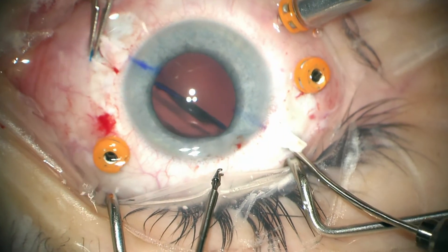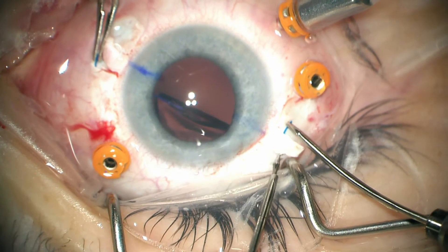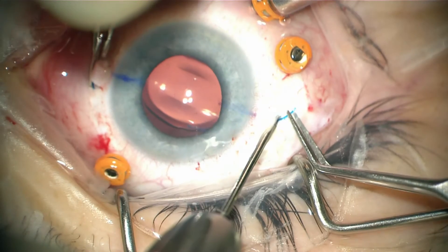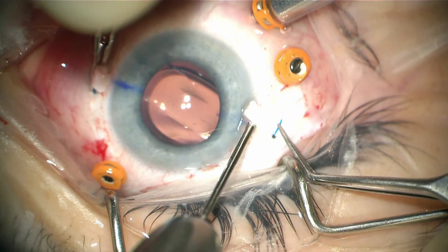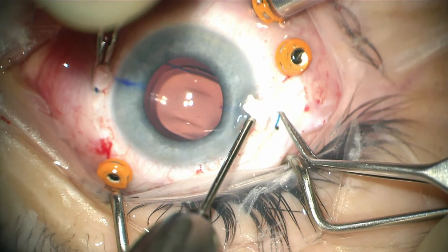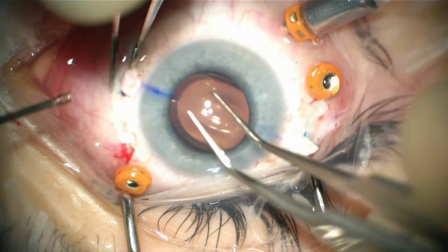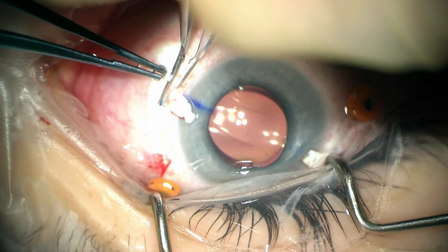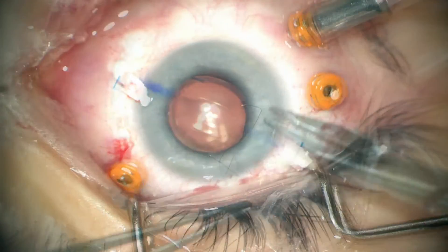Both haptics are now externalized and then tucked into the pockets that we made previously with the crescent blade. The wide pockets also make it easier to center the lens and result in less tilt. Both haptics are tucked and the lens appears centered and stable without any tilt.